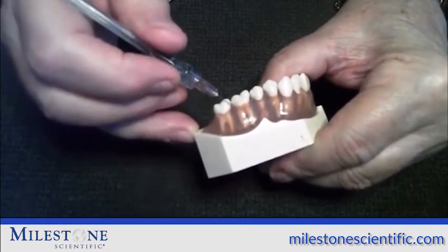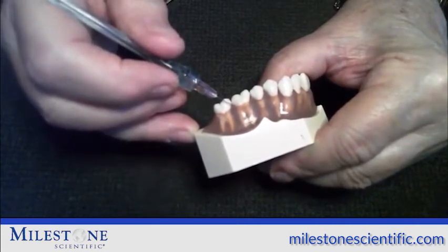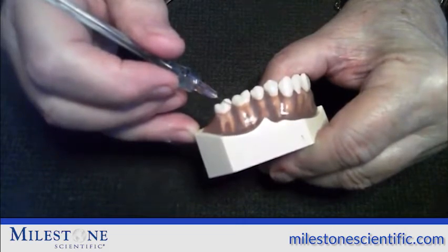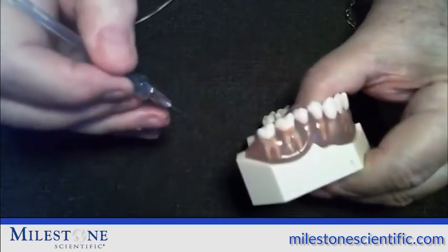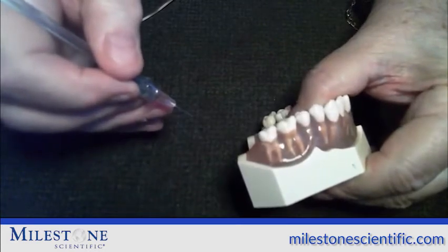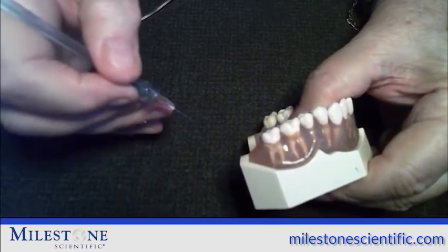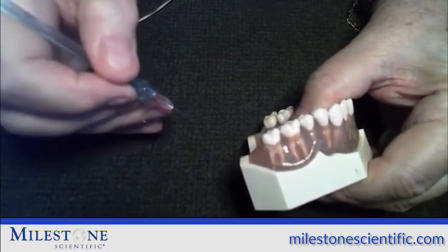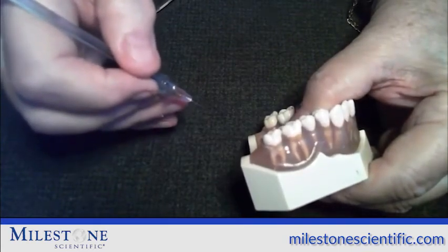If you delivered a quarter cartridge of articaine or a half cartridge of lidocaine, hit the foot pedal all the way to the floor, release it, aspiration starts — beep, beep, beep, one, two, three — take the needle directly out of the mouth. Then as the aspiration finishes, watch how much anesthetic comes out of that needle. It should be a drop or two — that's perfect. Where did that anesthetic go? It didn't come out — it went into the bone. You're going to have really good anesthesia.